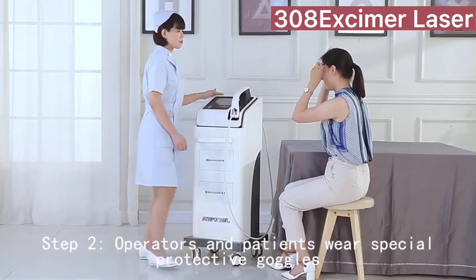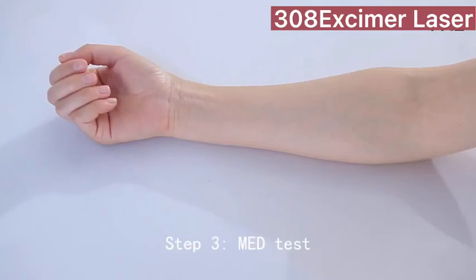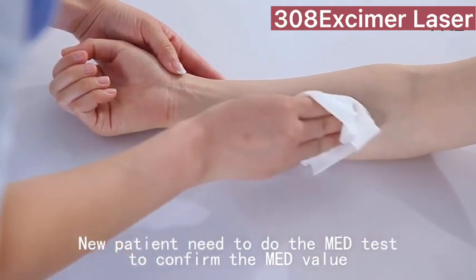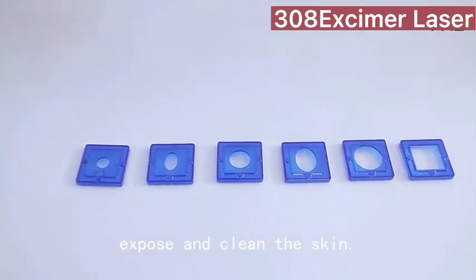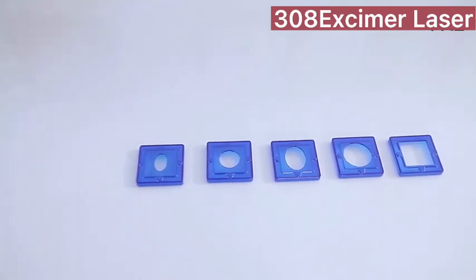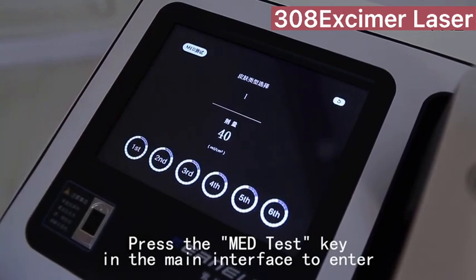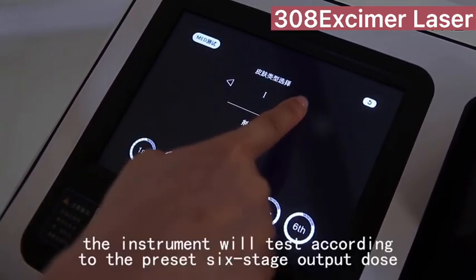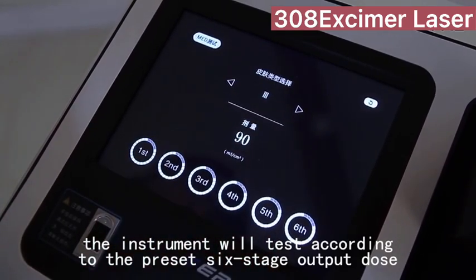Operators and patients must wear special protective goggles. Step 3: MED test. New patients need to do the MED test to confirm the MED value.